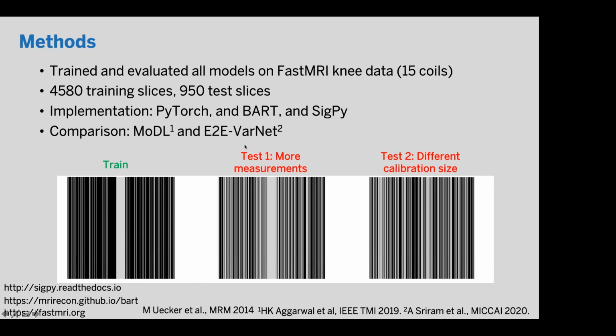Hi, John. Can I ask you a quick question? So for all the training data and the underlying image of interest, do you require them coming from the same set of coils?